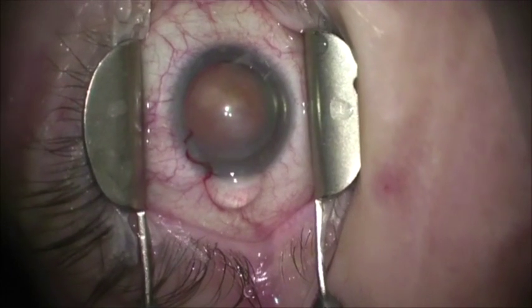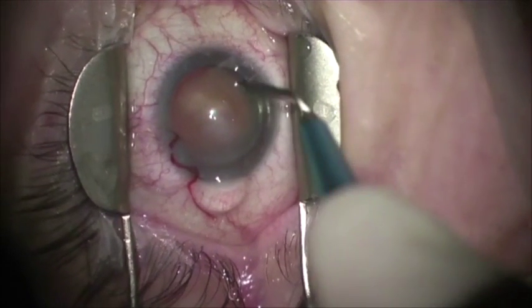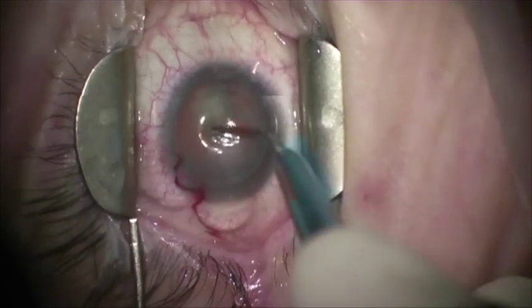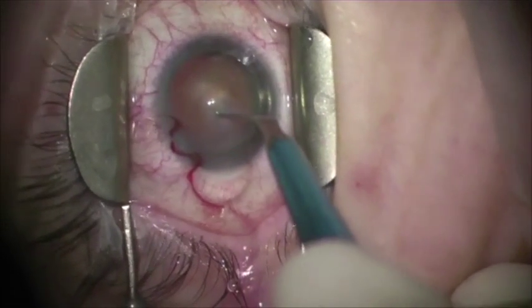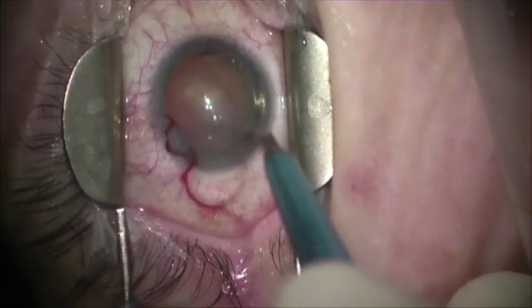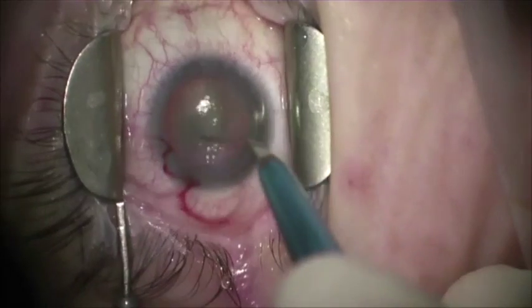Therefore, I went ahead and removed the subepithelial fibrosis, much in a manner that you might remove a Salzmann's nodule by peeling it off. After a little bit of work, it eventually peeled off nicely.